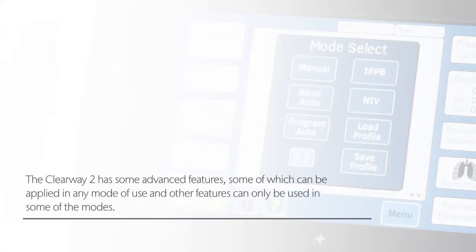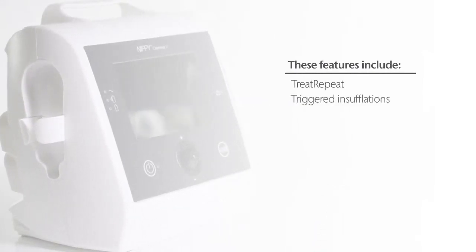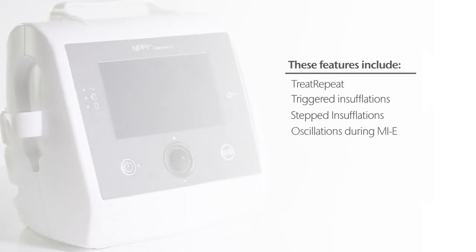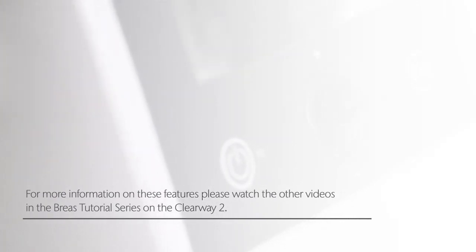The Clearway 2 has some advanced features, some of which can be applied in any mode of use, and other features can only be used in some of the modes. These features include treat-repeat, triggered insufflations, stepped insufflations, and oscillations during MIE. For more information on these features please watch the other videos in the Breas tutorial series on the Clearway 2.